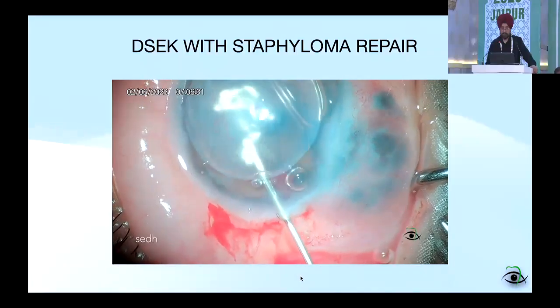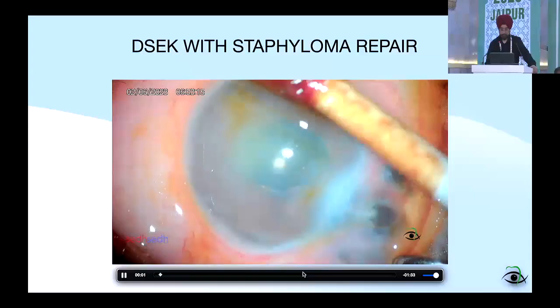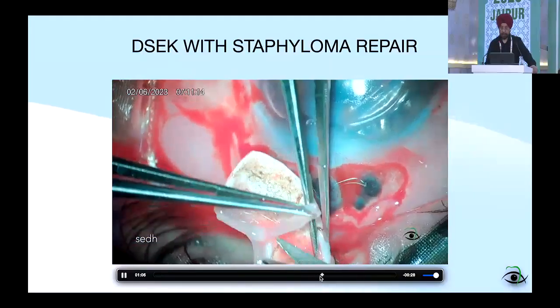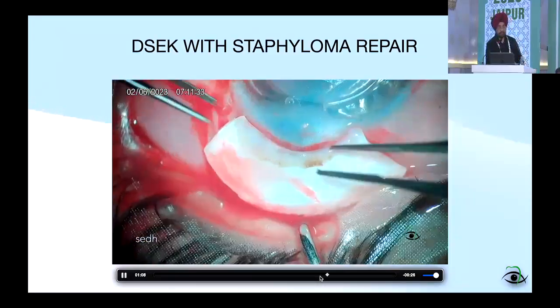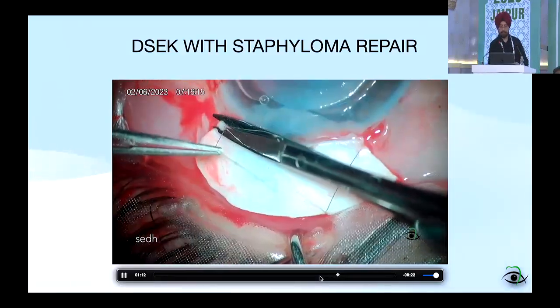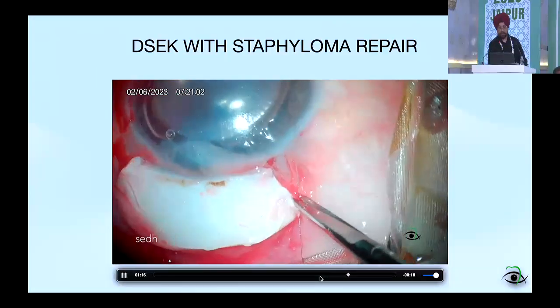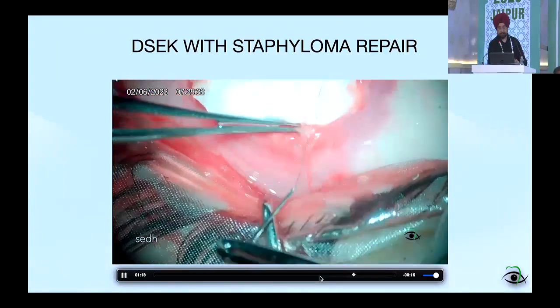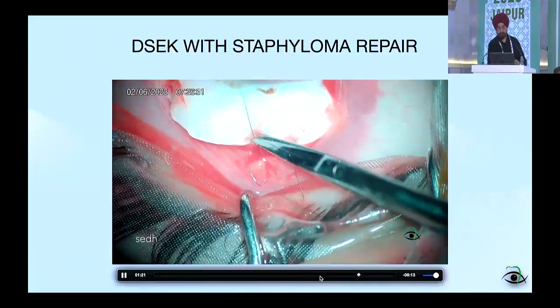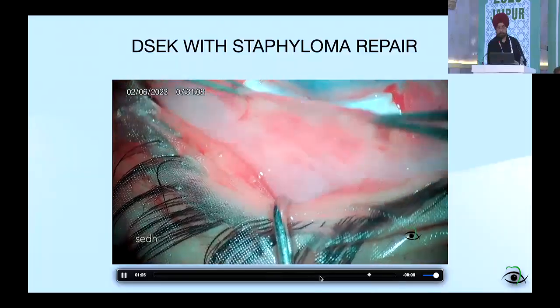Once you're done with the graft, then from the same tissue, you take an appropriate size scleral partial thickness graft and you cover that, after debriding the whole of the conjunctiva, making the bed properly fashioned.